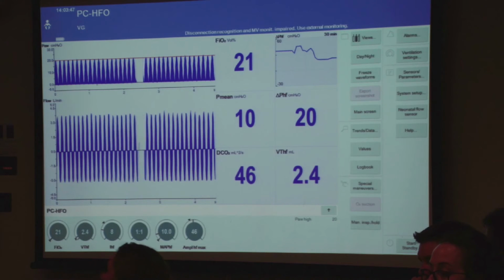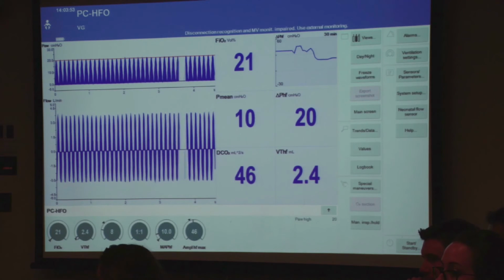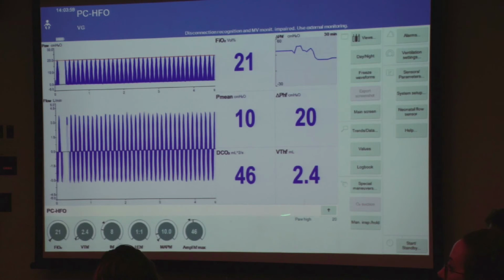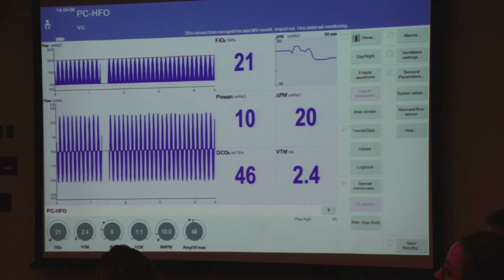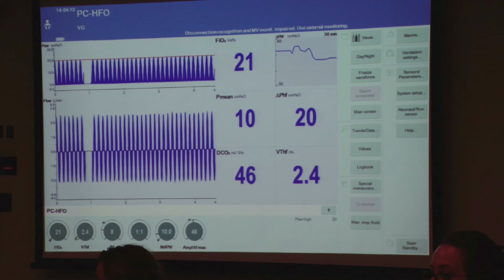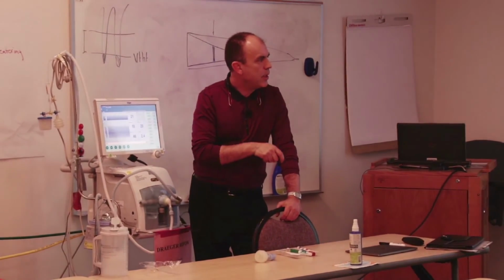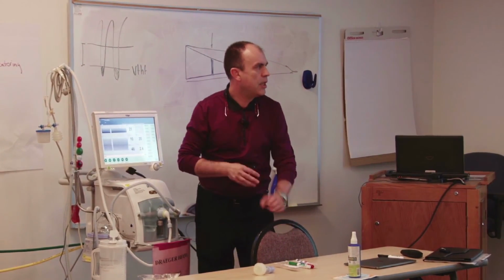Like, when you're practically using it, not for a protocol, when are you saying, okay, I've gotten the benefit of high frequency? When we are below 20 here and we're beginning to wean this and we're in our low 40s in PCO2s, we start dialing down the VTHF until a point where you can either extubate the baby directly or change to conventional, whatever the attending physician prefers. But generally, that is becoming more and more a parameter for us if we regulate that per kilo.